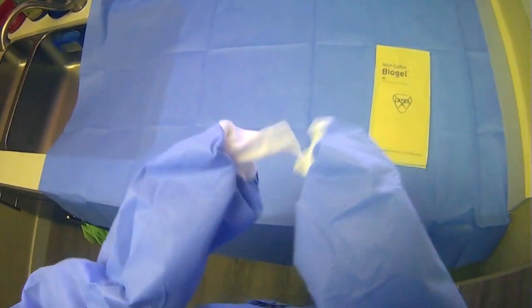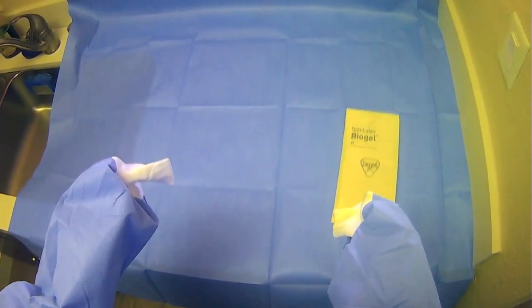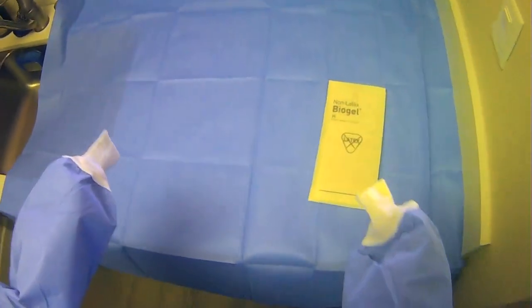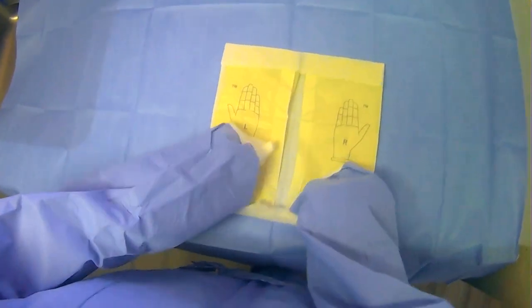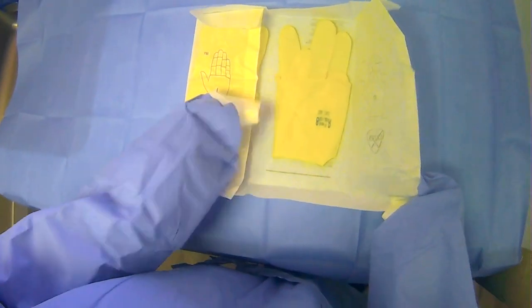So anyway, you'll open up the gown like we just did, and then you'll use your hands through the sterile gown to put on your gloves. Now, ideally someone will be tying you up while you are in this position, so you can ask, hey, can someone please tie me up? But regardless of whether someone's tying you up or not, you can now open up your gloves, and it's in the same fashion.